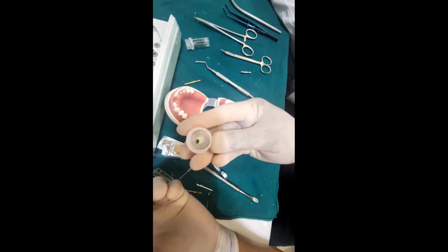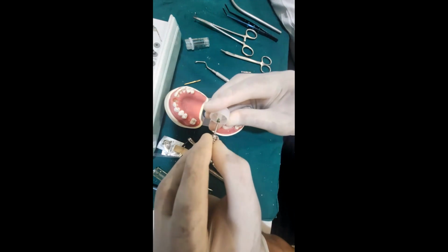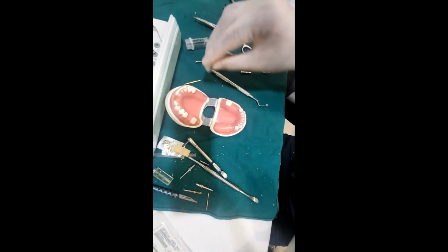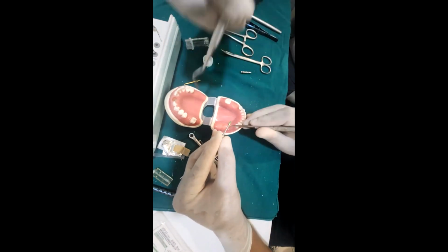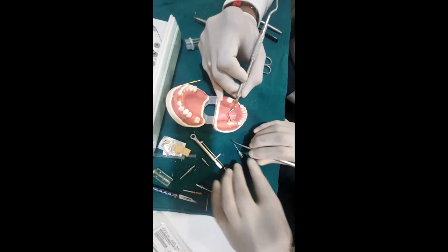You will use your screwdriver and pick up the cover screw and place it.